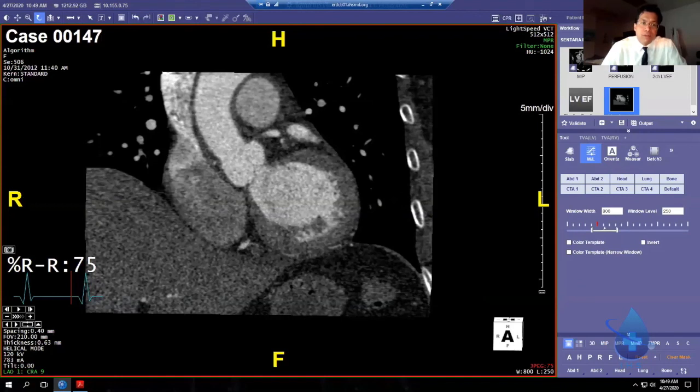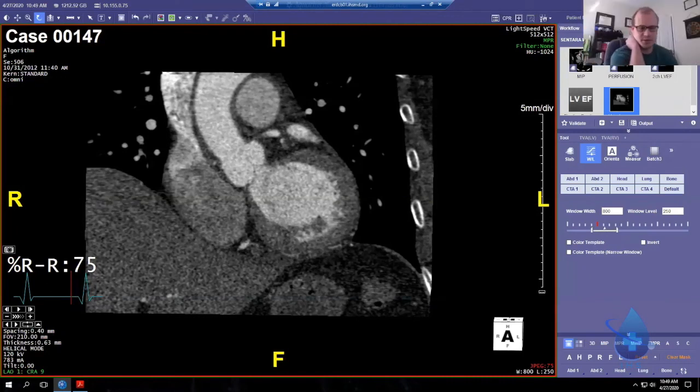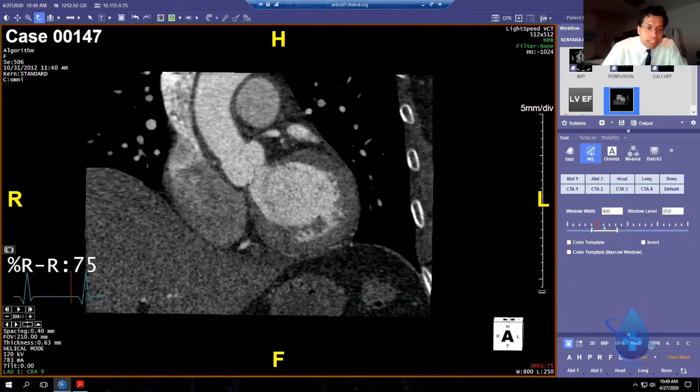If I showed you a black and white television, or a screen that's only in black and white, how many different shades of gray do you think your eyes can see? Guess. 15 to 20. 15 to 20, man. Somebody said that? You got glasses on? You doctors put your head down and looked at a book since you were age 18. Yeah, maybe your eyesight is bad enough at this point. No, you can see more than that. 40 to 50 shades of gray, just like the book, okay?